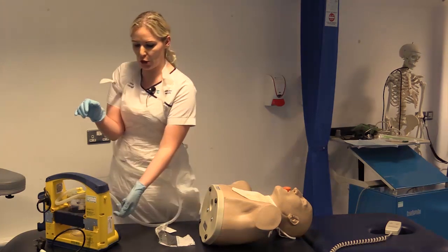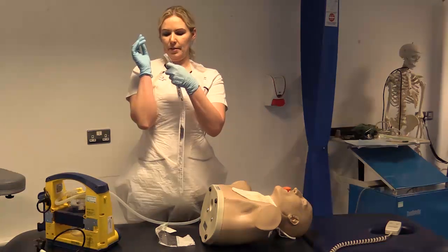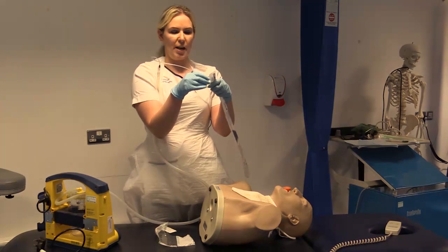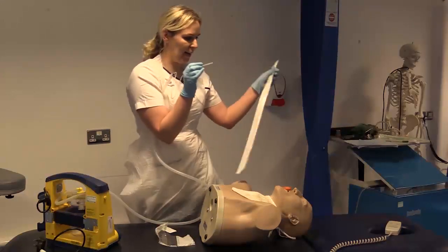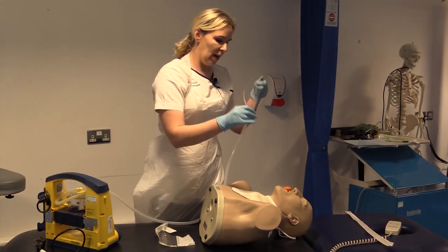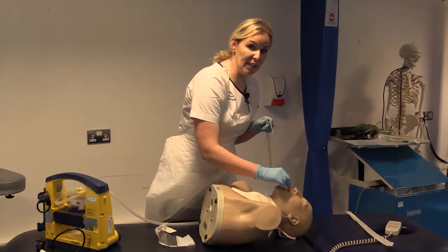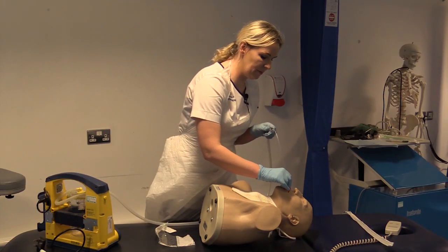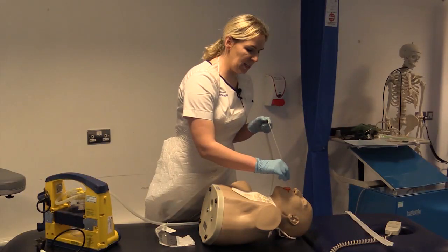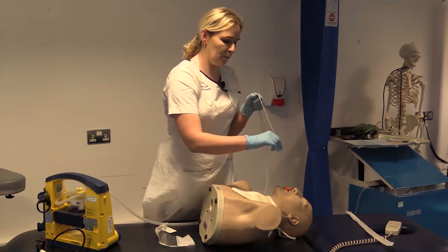We're going to turn on our suction, and again we're going to slowly remove our catheter from the sleeve, making sure our clean hand is the only hand that touches the catheter, and as we come out we're going to apply a thin layer of gel over the end of the catheter. Again, we're going to explain to our patient the suction is about to occur, and we're going to slowly insert the catheter into the airway. Again, what we're looking for is a cough or where resistance is felt. If resistance is felt, you come off about 1 centimetre, apply your suction, and you slowly come out, making sure you're getting all secretions as you come out.